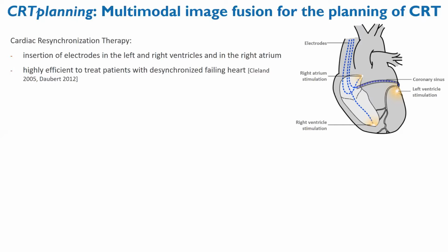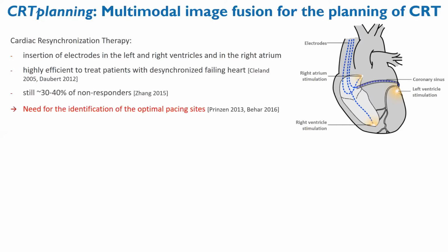It has been demonstrated to be highly efficient to treat patients with desynchronized failing heart. However, there is still around 30% of the patients who do not respond to the therapy. So there is a need for the identification of the optimal pacing sites.